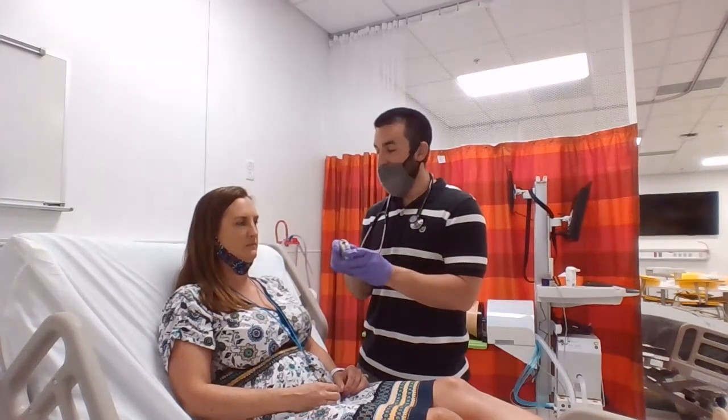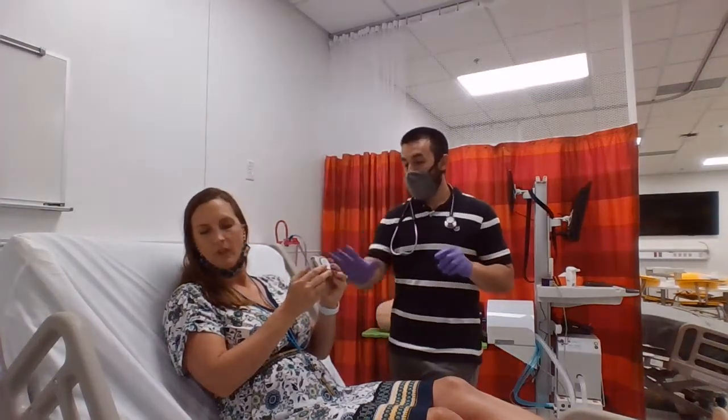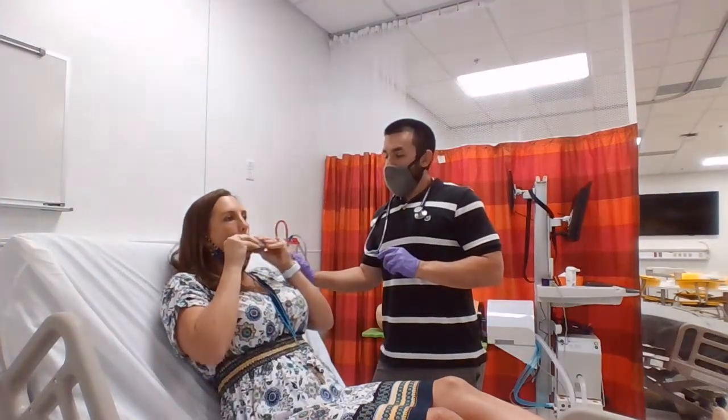We won't let pharmacy know about it. All right. I'm going to let you puncture it this time. And remember, blow away from it. Keep that thing in an upright position. All right. Go ahead and seal your lips. Big, fast, deep breath. Deep as you can go. And hold it.